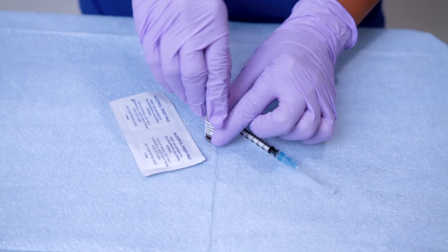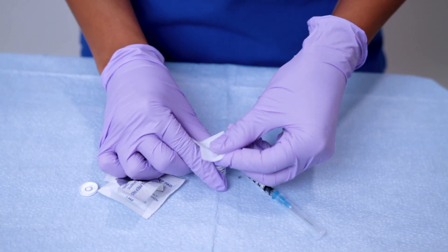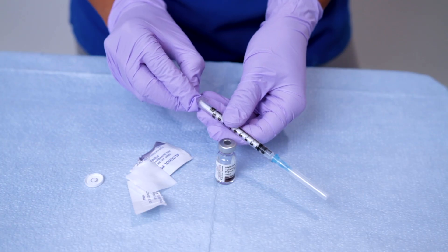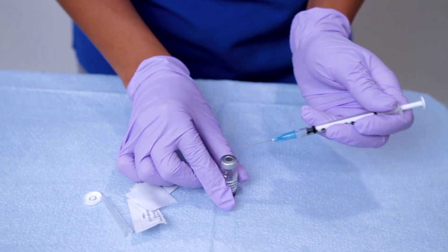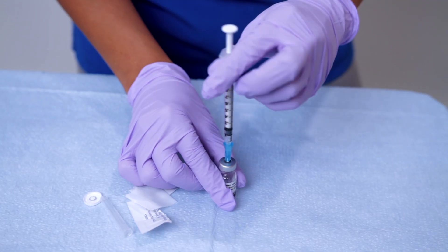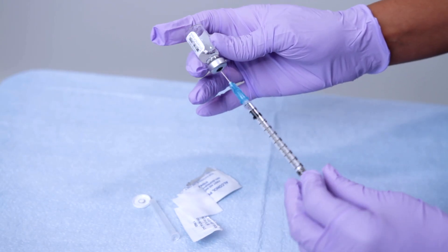Now let's draw up the dose. Pop the top and clean the top of the vial with an alcohol swab. Don't forget to check the expiration date. I'll be inserting the needle and drawing up carefully 0.1 mils of purified protein derivative — that's the exact amount for a TB skin test. As a pro tip, make sure there are no bubbles, as accuracy matters.